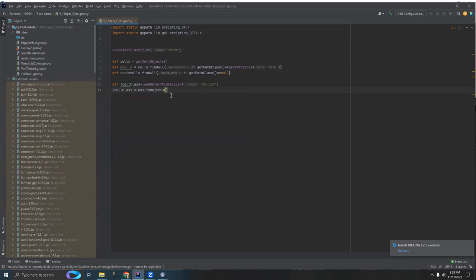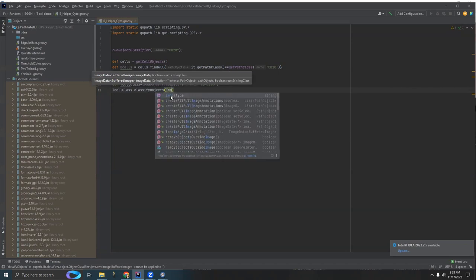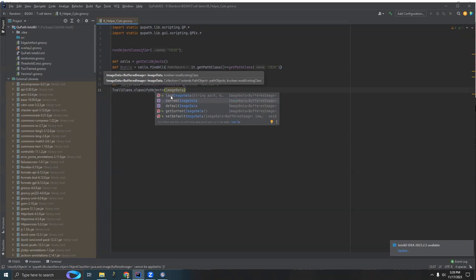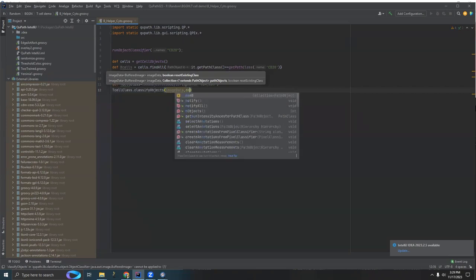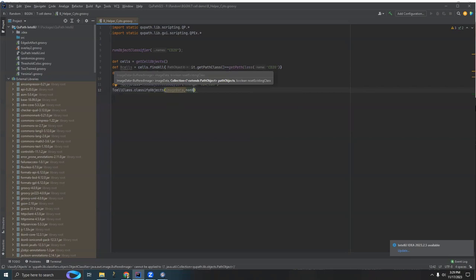So I'm going to hit tab just to load that. And then for the moment, I'm just going to type in image data. We haven't defined that variable yet, but we'll get there. Hit comma. And then it's asking me which objects would I like to apply this classifier to. And I'm going to say I want to apply it to the non-B cells. And yes, I want to reset existing class.